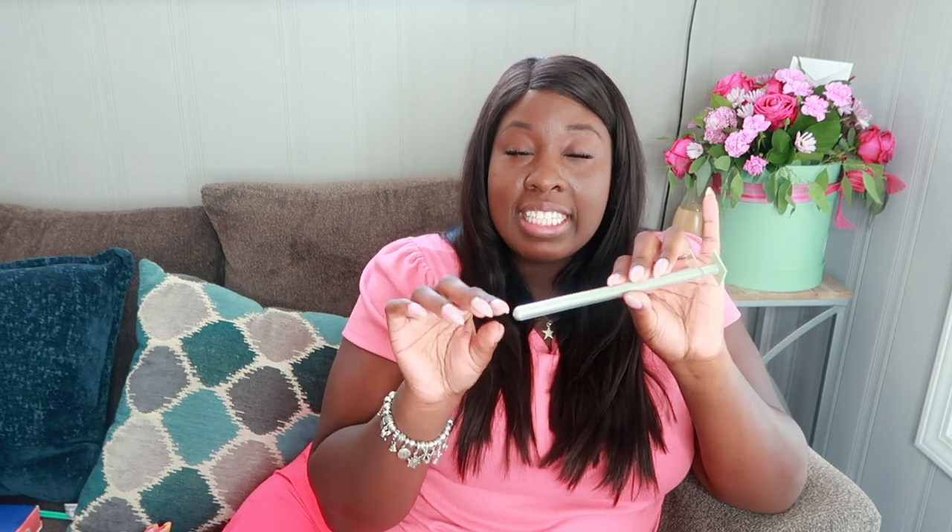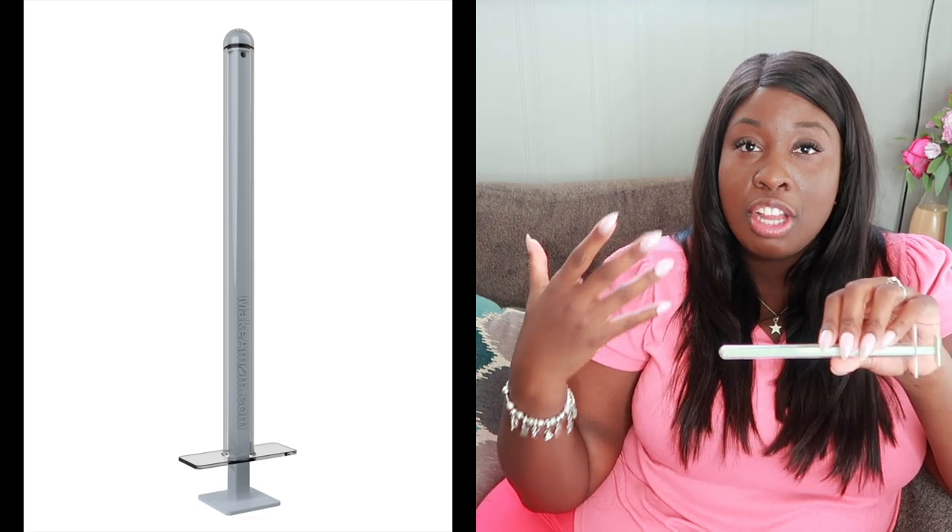Now you might be wondering, why would I use this syringe over a typical syringe that you would get at a pharmacy? The reason is because the makeamom syringe is specifically designed for home insemination. A standard syringe has a little tip at the bottom, and that little tip makes it difficult for the sperm to travel through. So when you're trying to start your family, with all the timing that's involved and the expense of purchasing sperm from a sperm bank, you want to make sure that you get every last drop out of that syringe and that you're really getting your money's worth. So you really want to have a syringe that is specifically designed for that purpose, like the Cryo Baby — a much higher quality material than a standard syringe.